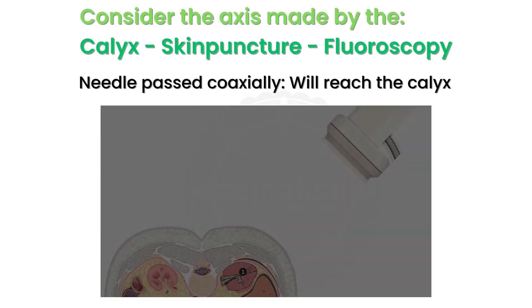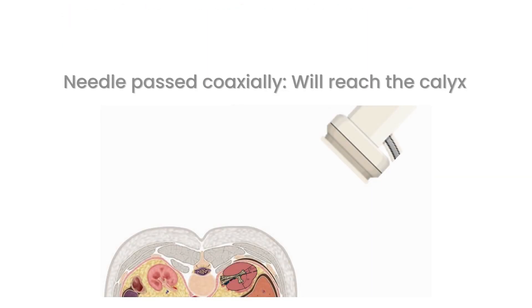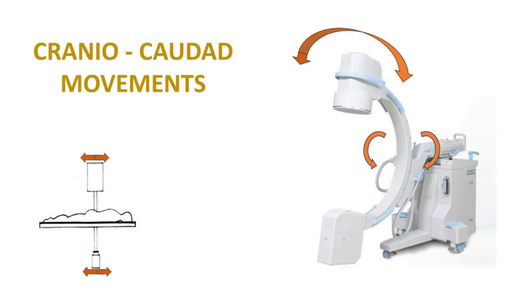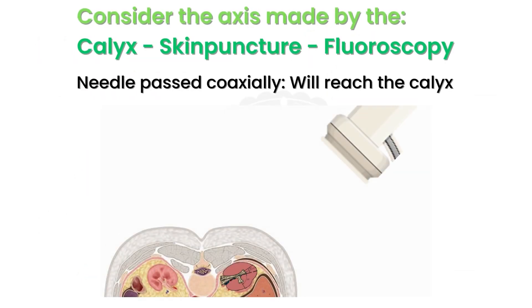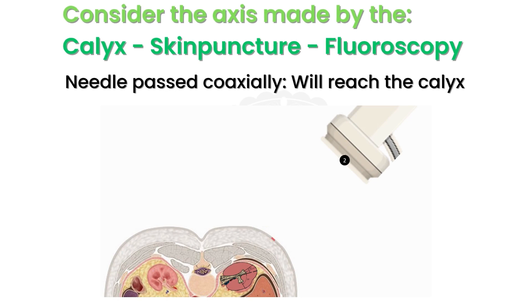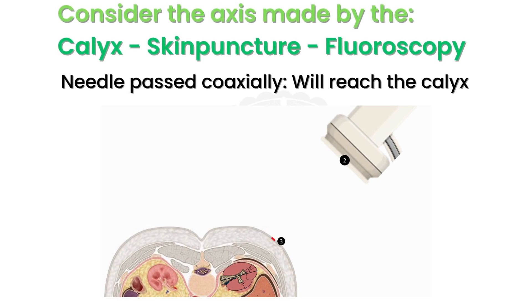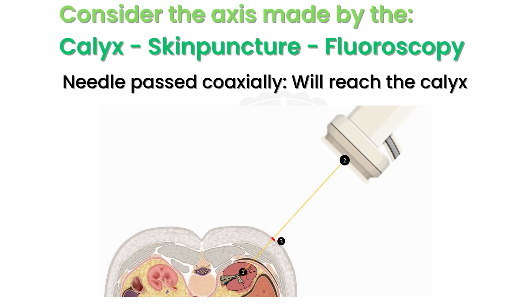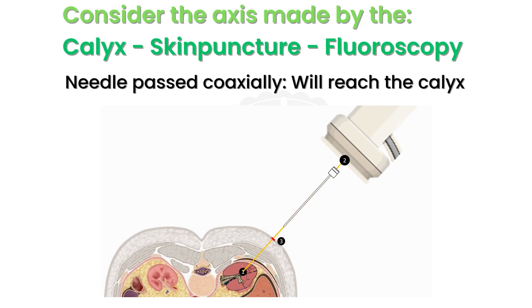Ask for apnea in expiration and turn the C-arm to approximately 30 degrees. The C-arm can additionally be rotated craniad or caudad to bring it more in line with the axis of the infundibulum of the selected calyx. Make a skin stab over the desired calyx. Now the target calyx, the skin stab, and the C-arm camera all lie in a single straight line.